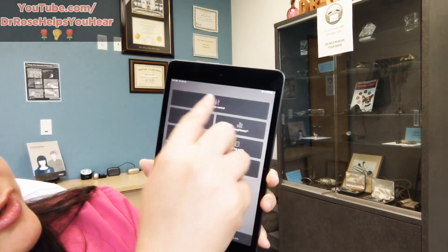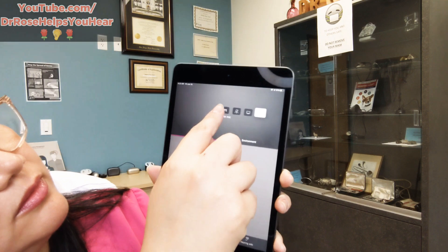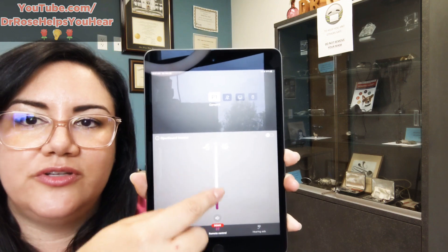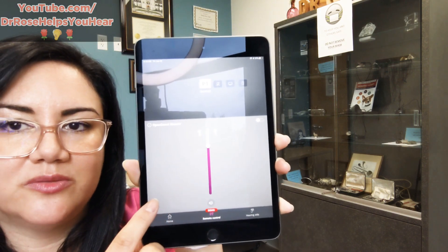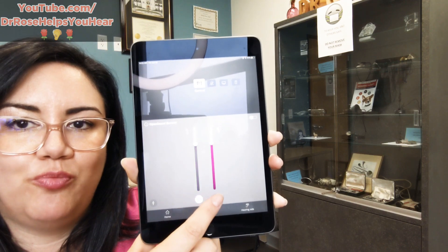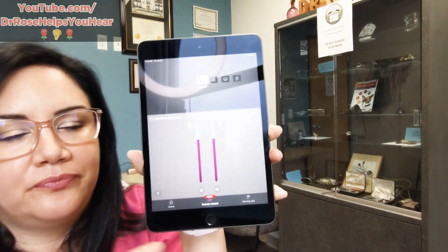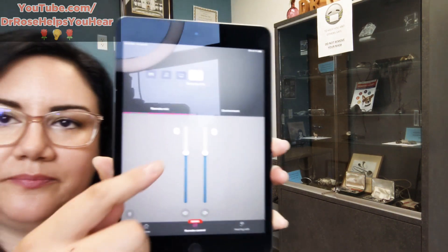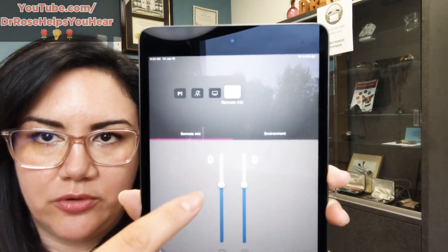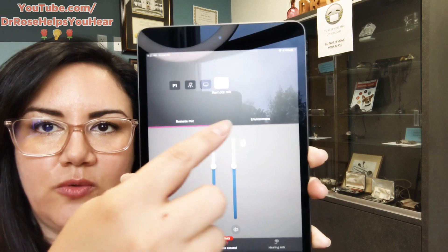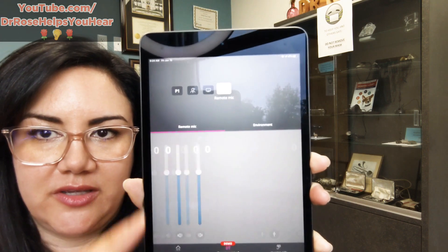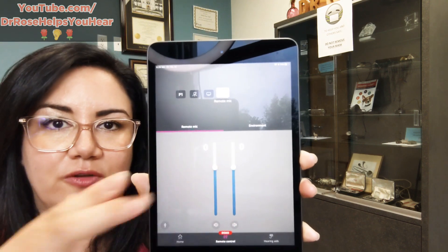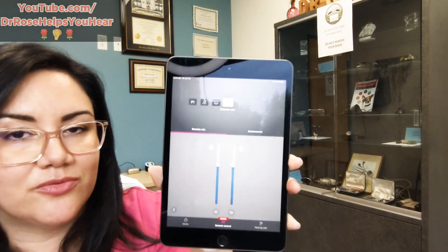For our purposes today we're going to go to remote control. The different programs are at the top here so that's how you can change your programs. The volume control is here to turn up and down, and if you hit this button it will split into right and left. You also have your mute buttons down here at the bottom. If you go to the remote microphone or the TV button, you have the ability to control the environment volume versus the device volume, so you can turn down the other sounds and just emphasize the sound coming from the microphone or the TV.